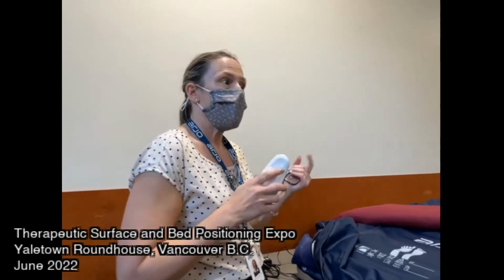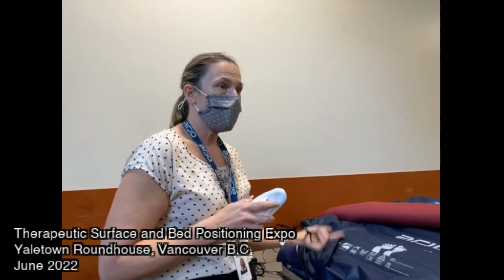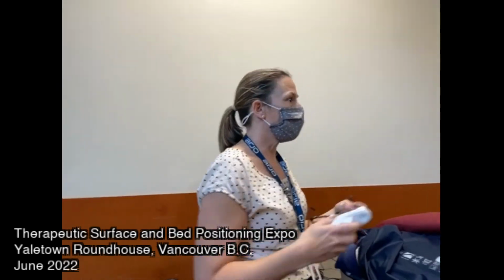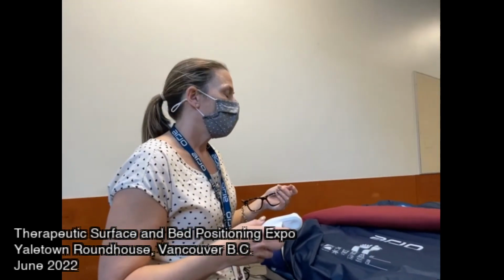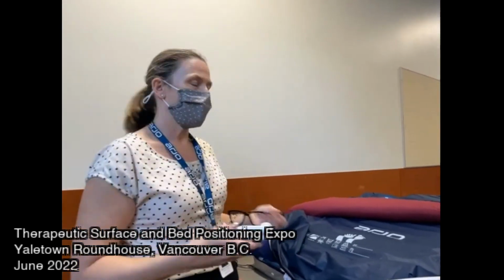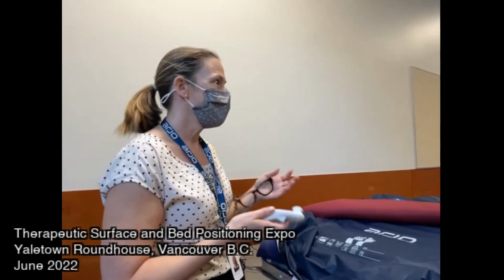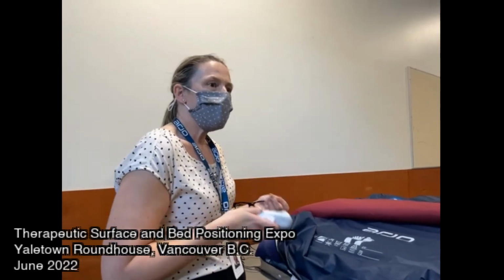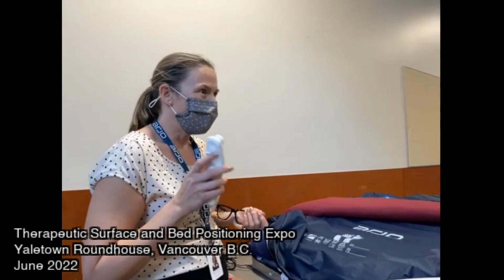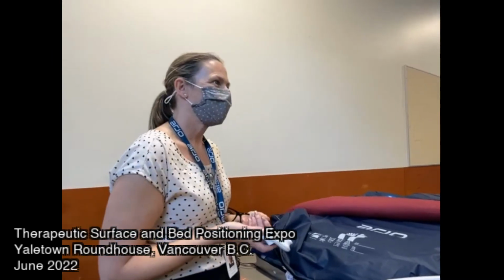If somebody has a high delta, say in the ankles, when they come from a hospital setting, then we're able to implement different treatments, whether it's raising the heels or booties. This can help you make that decision objectively because it's an actual measurement. Okay, super good.